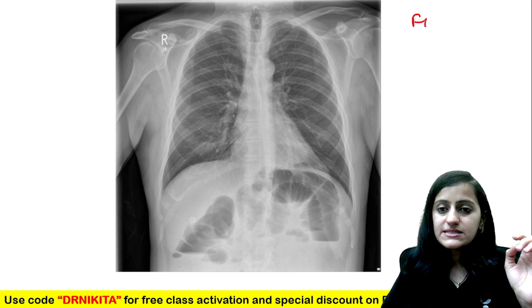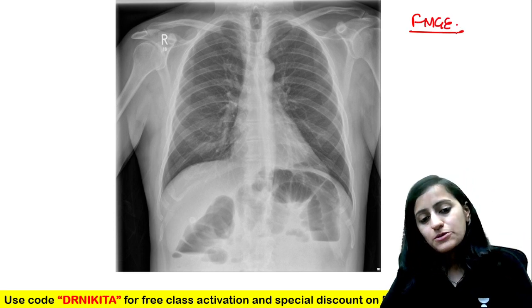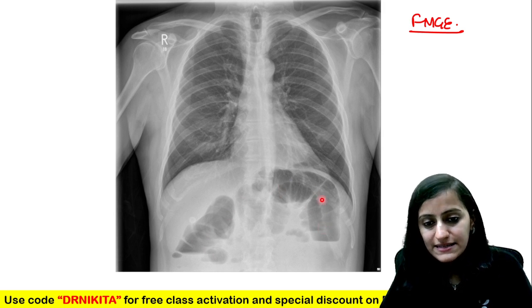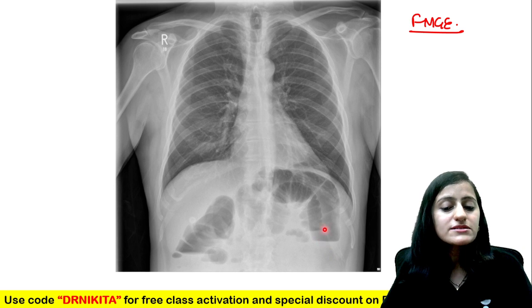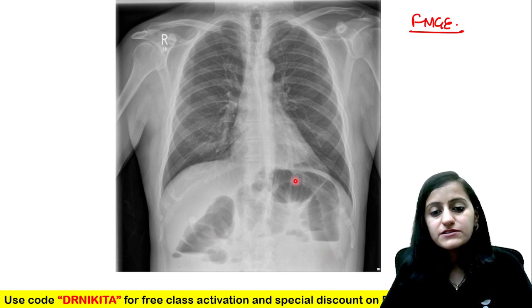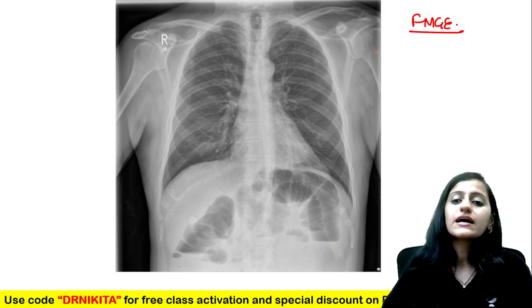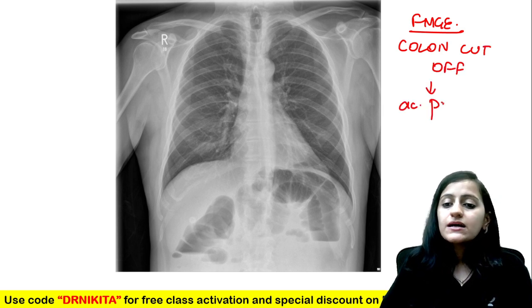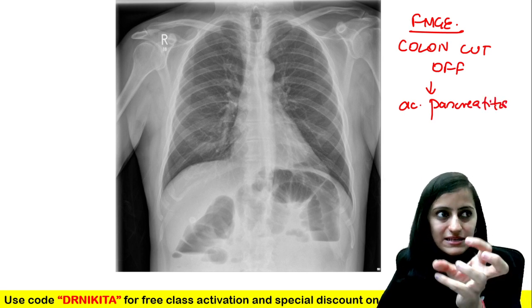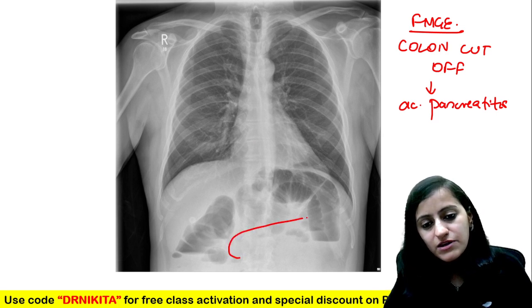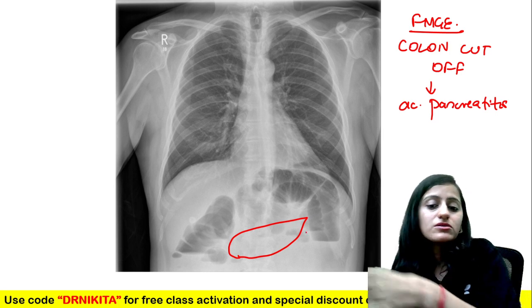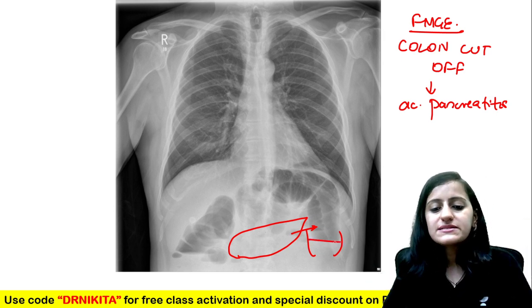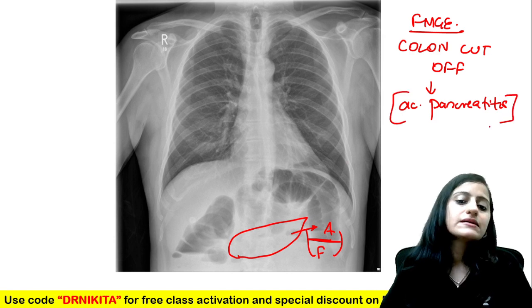The next image, which was asked in a recent FMGE exam: we see air in the bowel along the transverse colon, and suddenly the air is cut off on the left side with an air-fluid level — beyond this point there is no air. This is called the colon cutoff sign. While not specific, it is classically associated with acute pancreatitis, where inflammation travels through the phrenicocolic ligament to the left-sided colon, causing localized ileus and the air-fluid level.